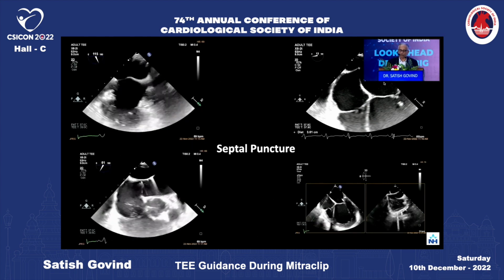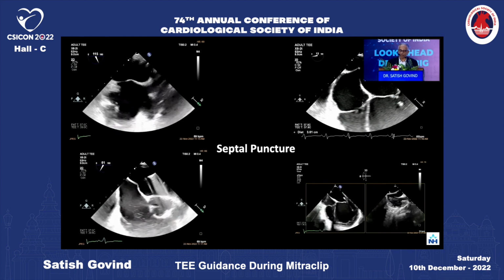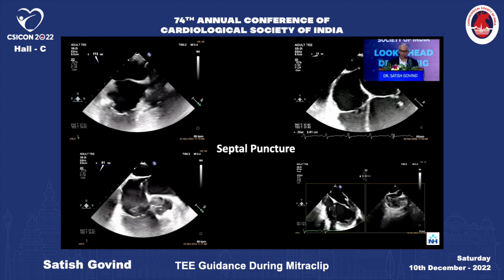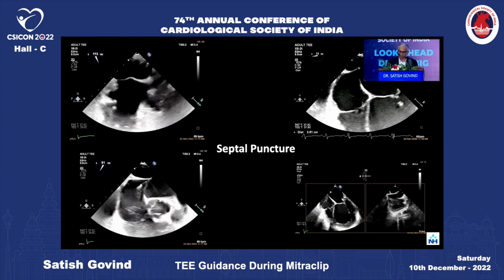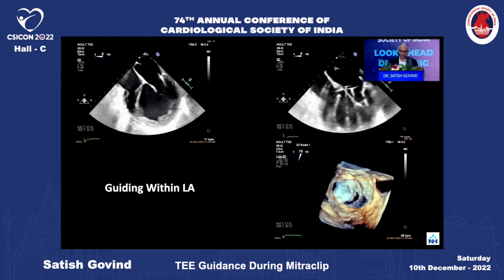And then finally, in the four chamber view, you again confirm where the tenting is and look at the height, and you already decided earlier, so you fix that. And then once it is done, the go ahead is given, and then the puncture is made. And this is usually seen in the short axis or the X-plane of the bicaval.